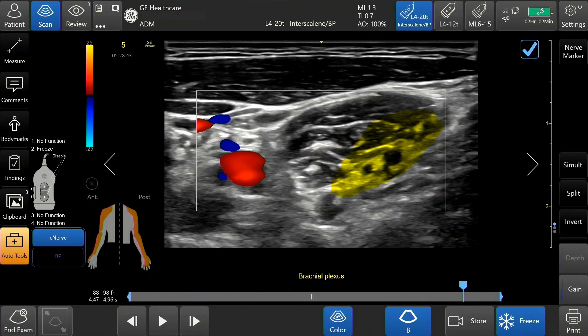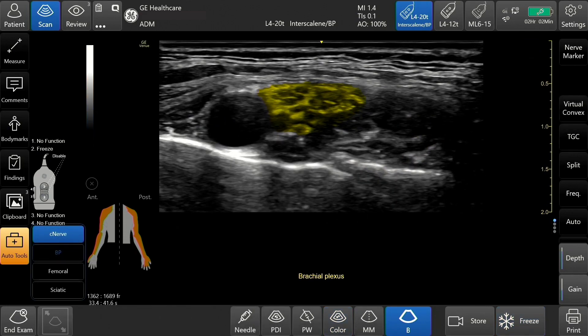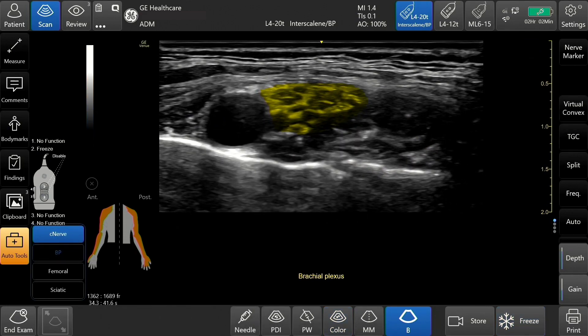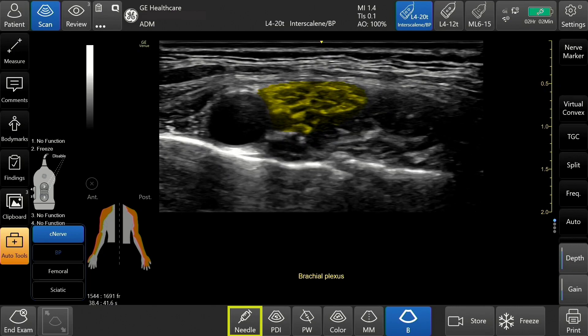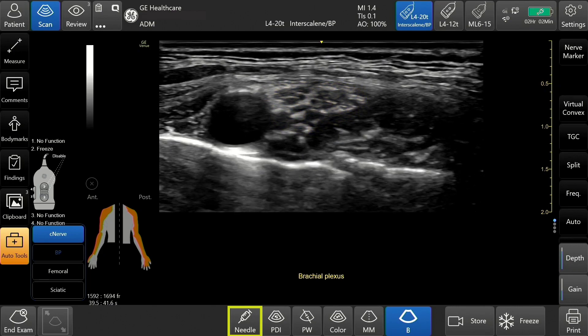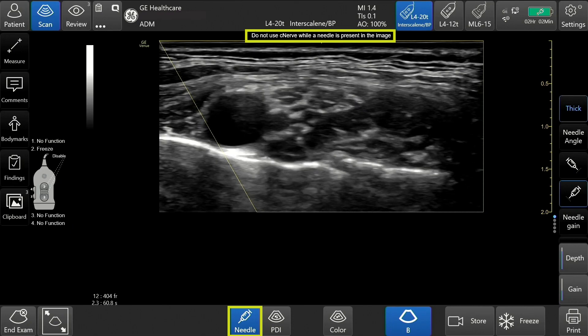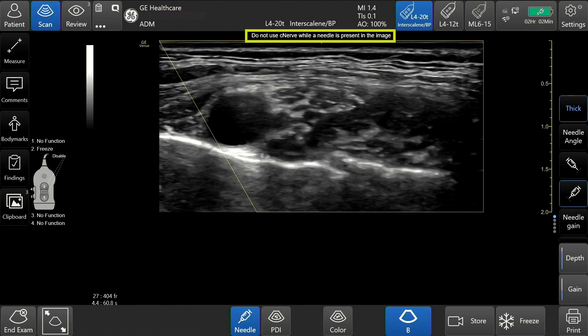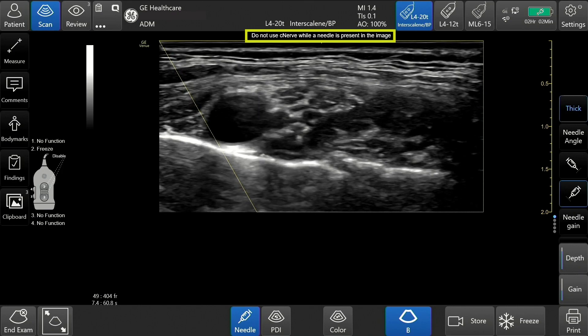The C-Nerve tool can be used in B-mode or in conjunction with the color or PDI modes. C-Nerve cannot be used with needle mode. While in needle mode, the C-Nerve tool is always deactivated and not available. C-Nerve is currently not compatible with the presence of a needle in the image.